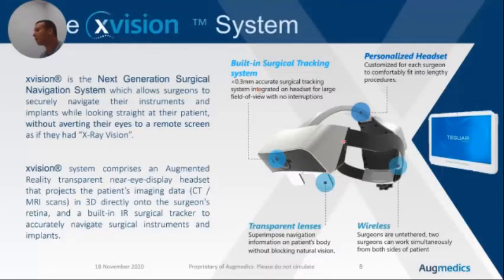The headset is personal for the doctor, and let's go in, but this navigation system gives some X-ray vision to the doctor that does the surgery.